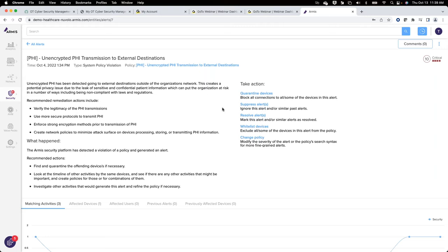Yeah, and protocol analyzers, right? Exactly. All these devices within different versions have a certain fingerprint or pattern of how they communicate, even within something like a Windows 7 system with a certain patch revision has a specific type of signature associated with traffic. So taking that and putting it in our knowledge base in the cloud, we can deduce, hey, this is a Windows 7 with only service pack 1, as we saw the type of traffic it was generating.